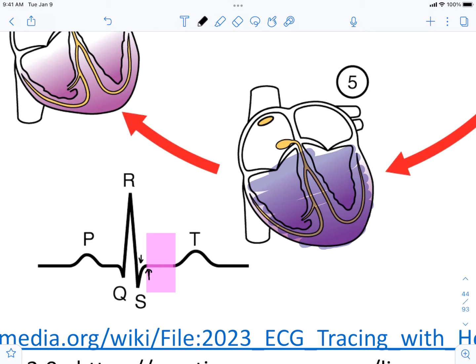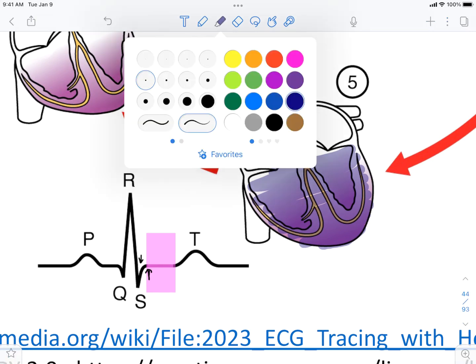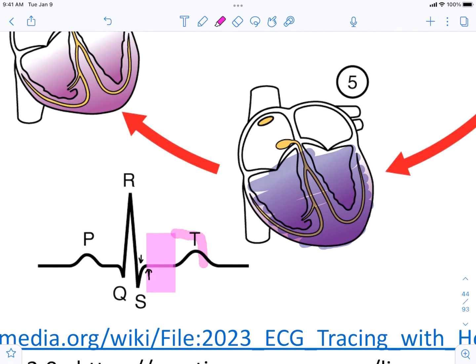Actually, in some cases, it'll begin a little sooner. But interestingly enough, it'll actually continue. So if I were to continue to take this box out longer, it will actually continue during the T wave as well. And in fact, if I were to overlay the pressure diagram from the Wigger's diagram to look at just the pressure being generated by the heart, I would have to draw the isovolumetric contraction phase here, and then we'd enter ventricular ejection, and we would continue to be in ventricle ejection phase for the most of the T wave before finally entering into that isovolumetric relaxation phase.